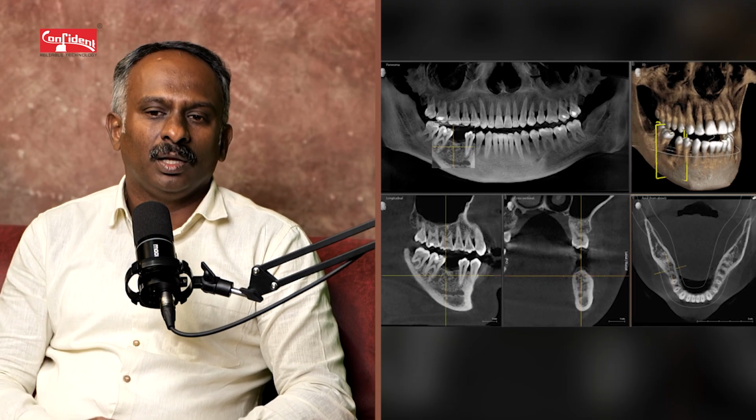At the same time, we also have magnification in a panoramic radiograph, which would be totally negated in a CBCT. Meaning to say, we have a 1:1 ratio of the measurement and size in a CBCT as in comparison to a panoramic radiograph, that is OPG.